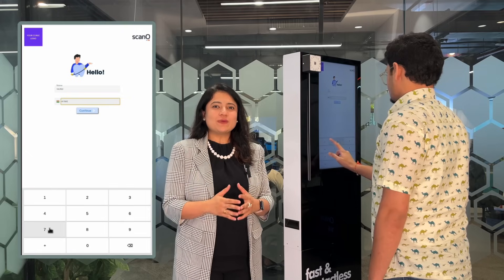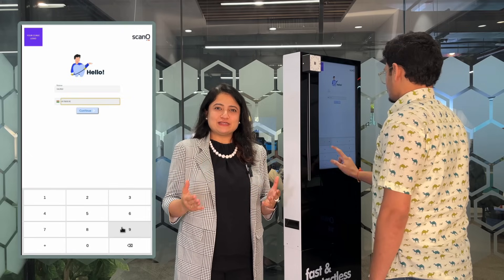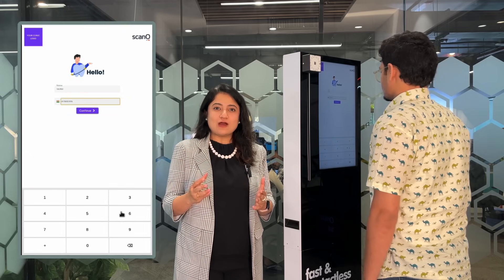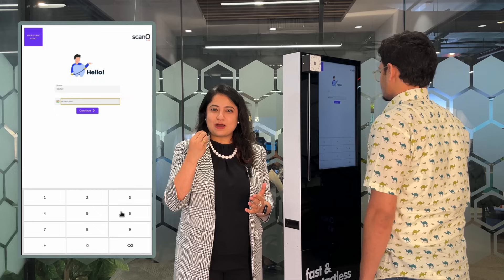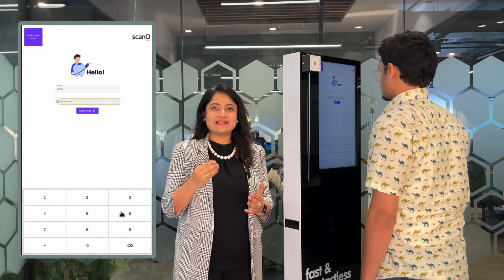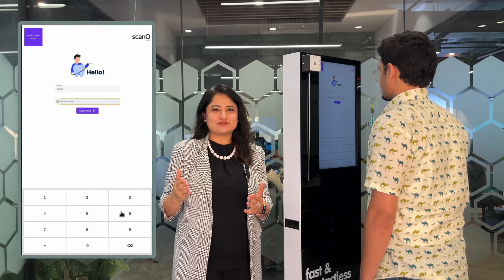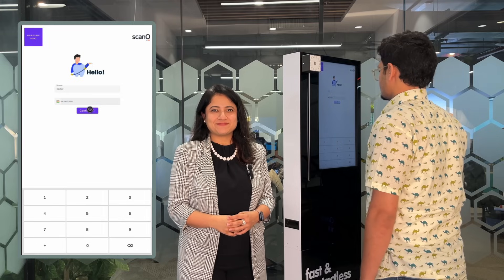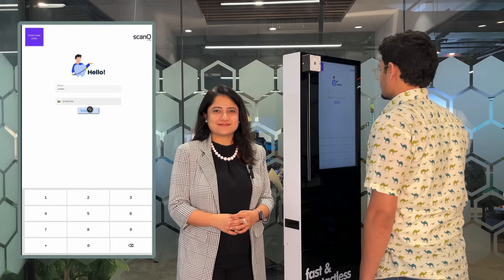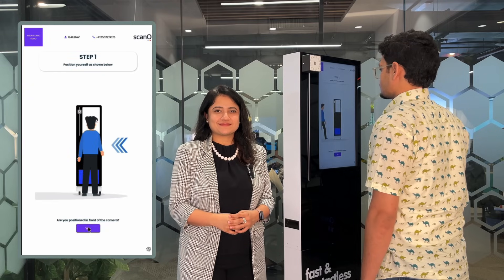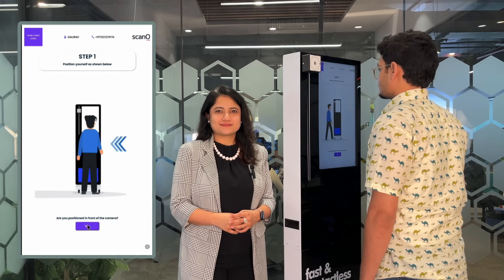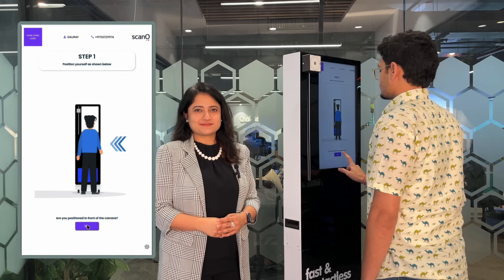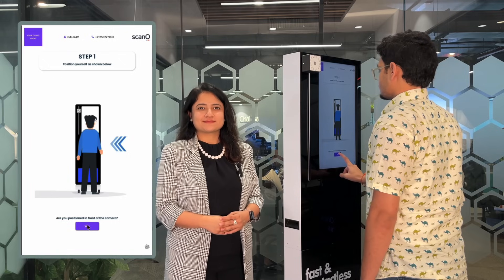The machine automatically guides the patient where to stand and how to open the mouth in order to get the right photographs of his oral cavity. Stand in the center of the camera unit and click yes after positioning yourself as shown.